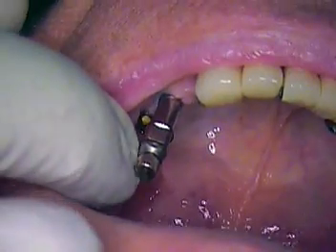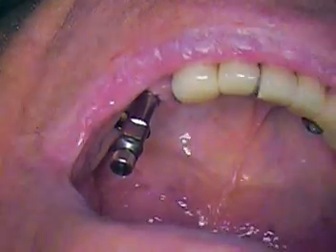We'll thread that in. Now I'm just going to go ahead and tighten our abutment. Just double check that. Yep, that's it. That's five minutes.